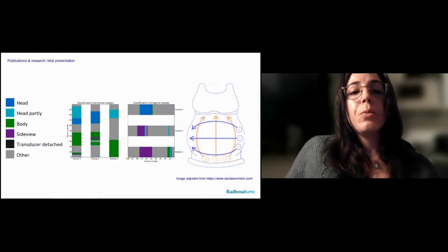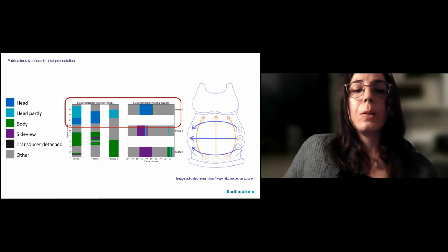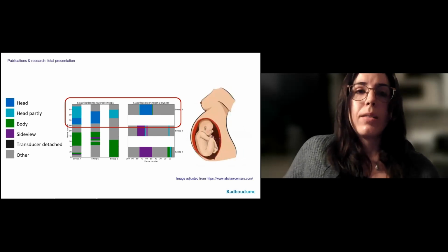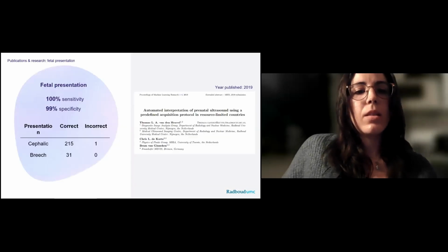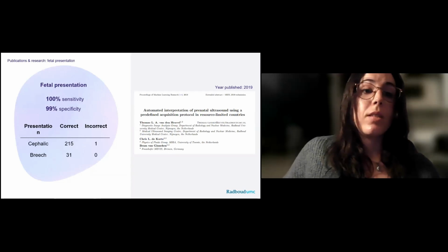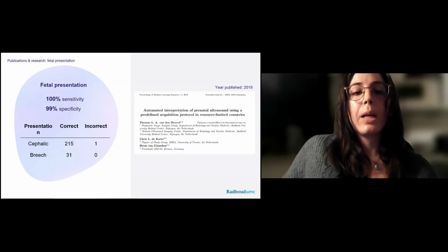Analogously, in this case, we see that the opposite happens. We see some frames of fetal head at the top of the sweeps, or the top of the abdomen, and some frames of fetal torso at the bottom, which means that we have a case of a breech pregnancy. This case is really important to identify because we should refer to a proper level of care.